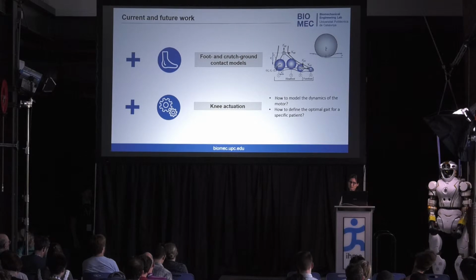And when this is done, our next step will be to add the knee actuation to this framework and see how to model each one of these parameters of the knee angle trajectory that are the ones that we want to optimize for each patient.